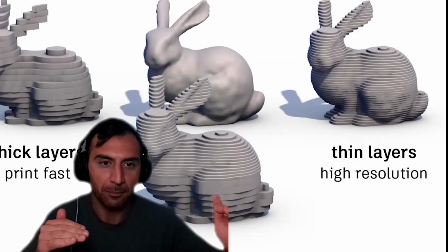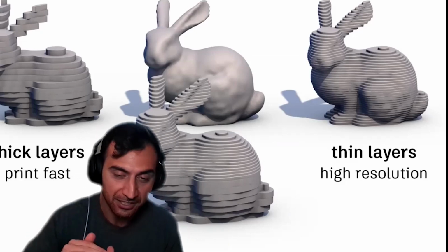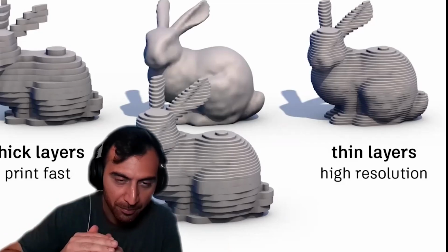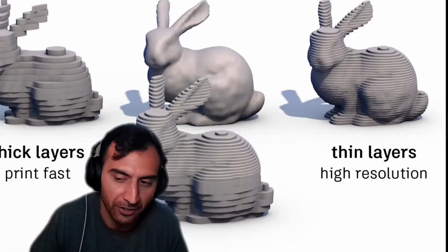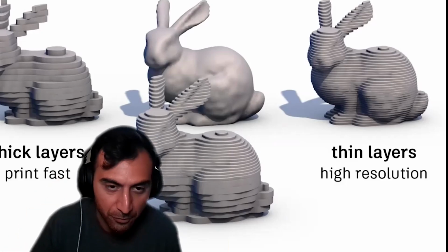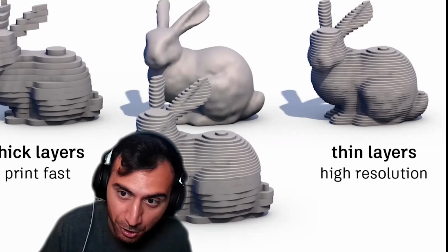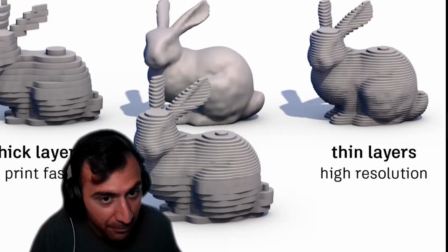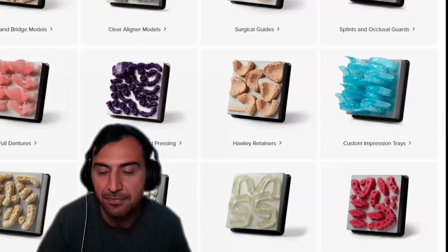So if you want to print more layers, it's going to take longer. It needs to print, cure, raise the lever on the machine, move back in, and print another layer. If it's doing that a bunch of times, it's going to take longer. If it prints a thicker layer each time, it's going to print faster. So if you want to print faster, you print with thicker layers, where you're going to have less resolution. If you want to print something with high resolution, it's going to take longer, with a bunch of little layers. So you have to keep that in mind.